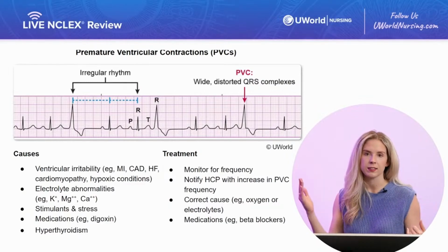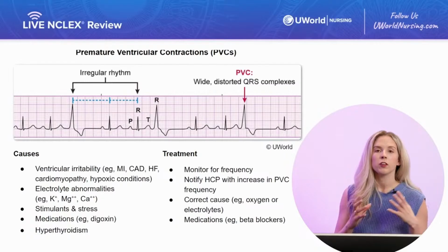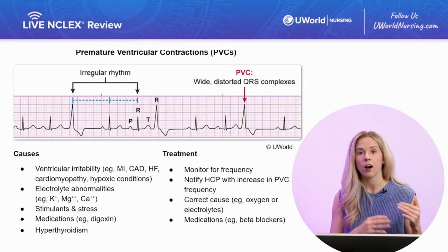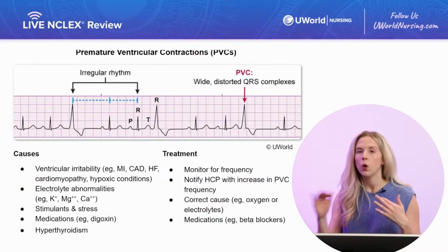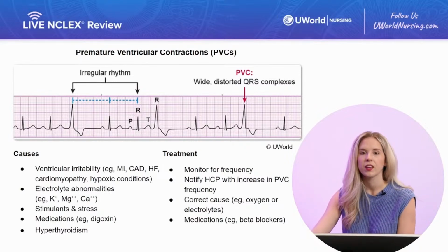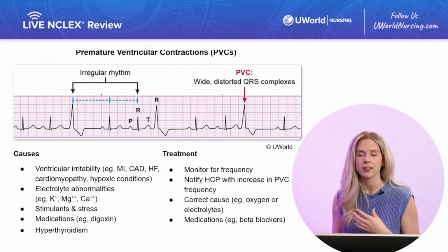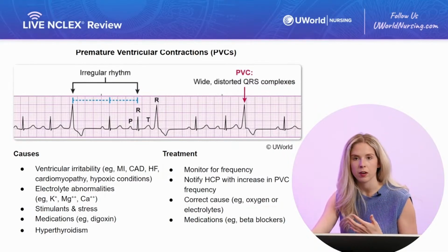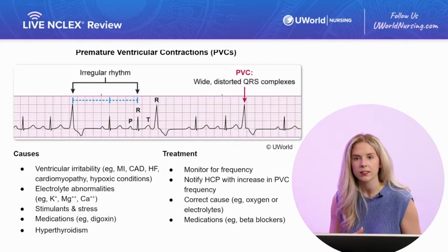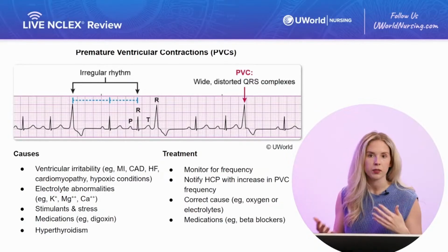It's not going to be a consistent rate. We'll also have an irregular rhythm, which means the transition from atrial electrical activity on the ECG to that ventricular electrical activity on the ECG will not be a smooth transition. So this irregular rhythm will look like a hidden P wave in the QRS, essentially like an out-of-sync jolt in the ventricle is going to hide that P wave from us. And since our P wave is hidden, we're not going to have that measurable PR interval. We can't have a PR with no P.